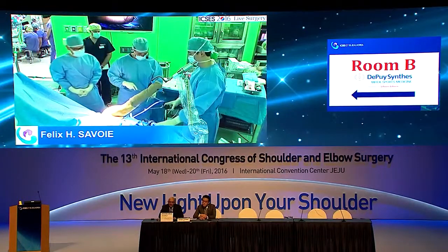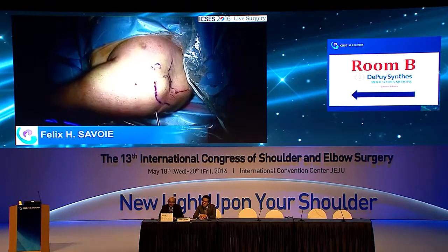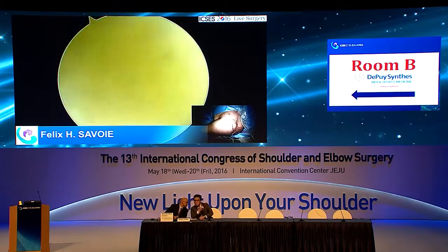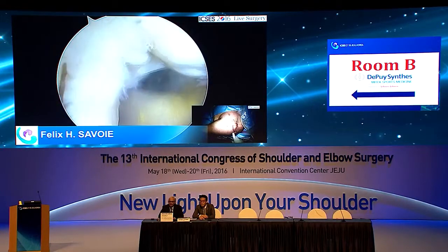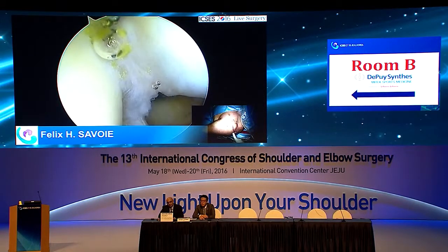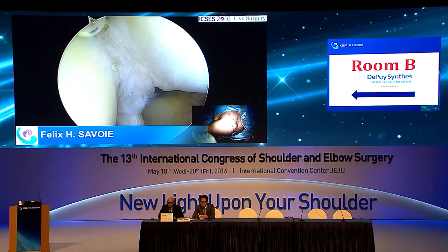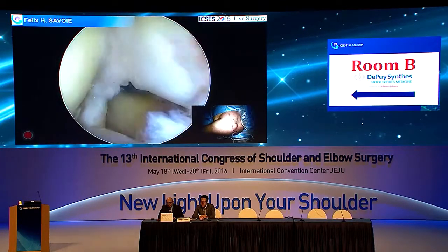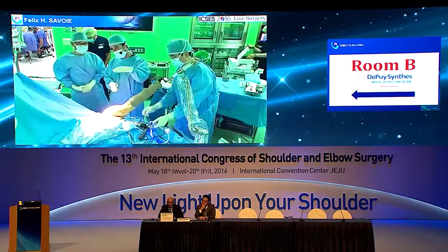We take a quick peek. I'm going to take everything apart now. It's a good question, and it's worth taking a quick look at if we can. With the water on. Sorry for it. Oh, we went out. So see the capsule? The capsule is put back, right? That's capsule you're looking at. That's not tendon. So the capsule is back attached where it's supposed to be, which is right off the articular edge. That's our interval, which is still open. Our subscap looks fine. But that's the capsule there that's now pulled back where it's supposed to be. It's fun to look in. It wasn't necessary, but you didn't have to take my word for it. But you put the capsule back as part of that repair.